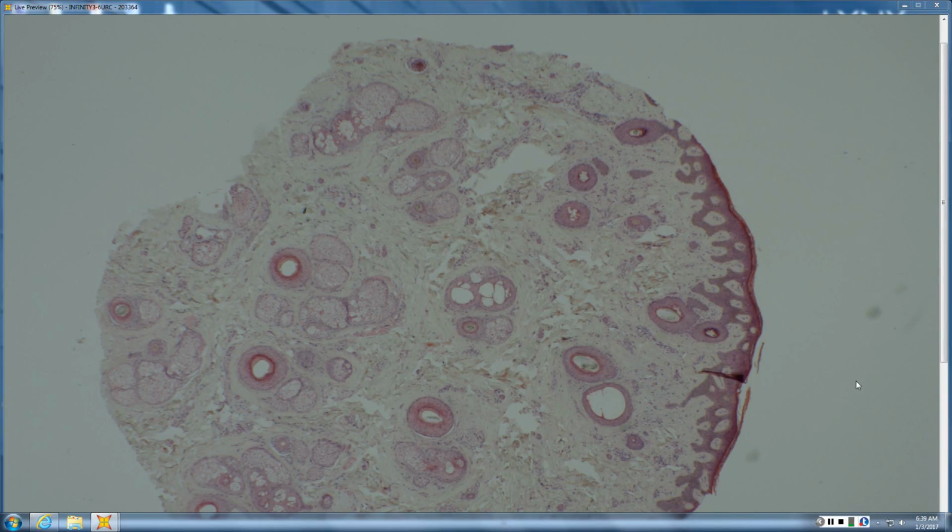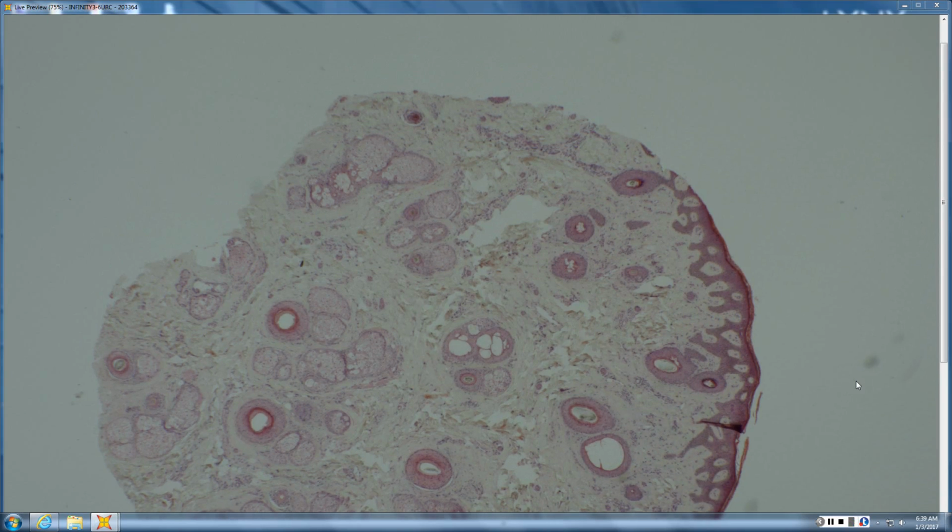So, morning. This is the hair chapter. There are also other skin appendages, so there are some miscellaneous things thrown in, including hair shaft abnormalities. There are a couple of those in here. This first one is supposed to be pattern alopecia, and this one is actually decent for it.